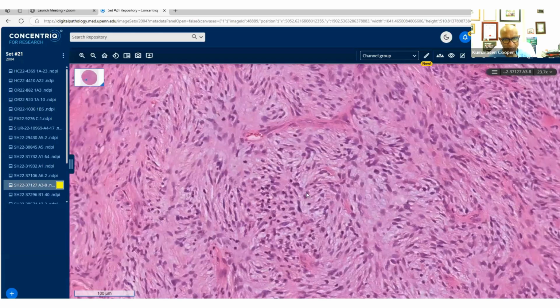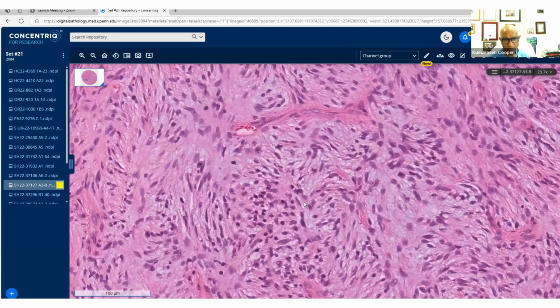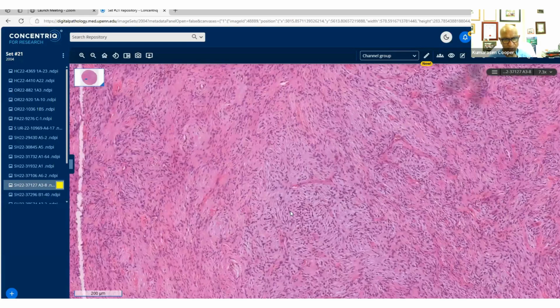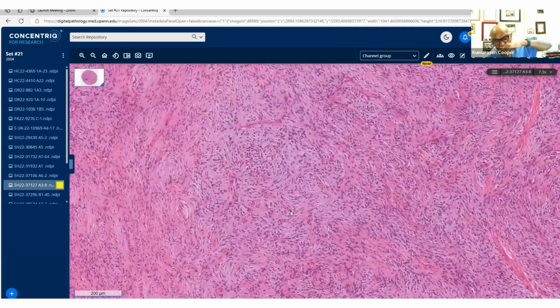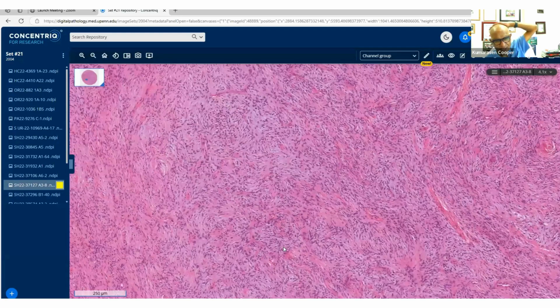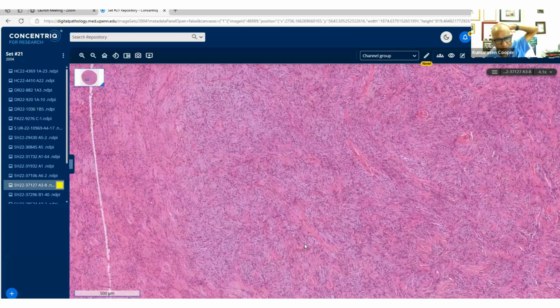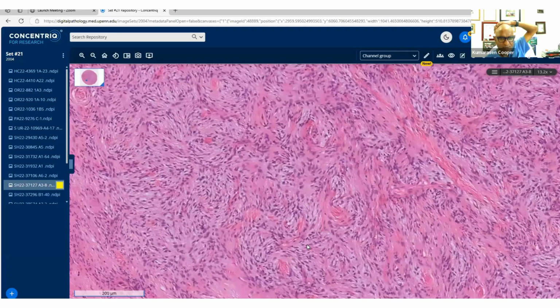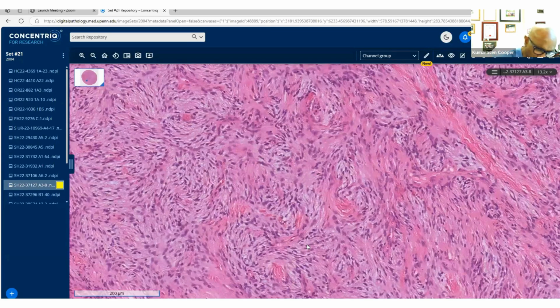Here again, Carla, just to come back, that MUC4 you wanted would be very useful, and we did do it. That was negative. I have a deep respect for low-grade fibromyxoid sarcoma, and the MUC4 always helps me in that regard, and that's positive. And we typically would then resort to FISH analysis to confirm the fusion. And the partners either FUS or EWSR1. So FUS usually in low-grade fibromyxoid. So perineurioma, don't forget this when you think of nerve sheath tumors, and then further, don't forget the hybrid tumors.